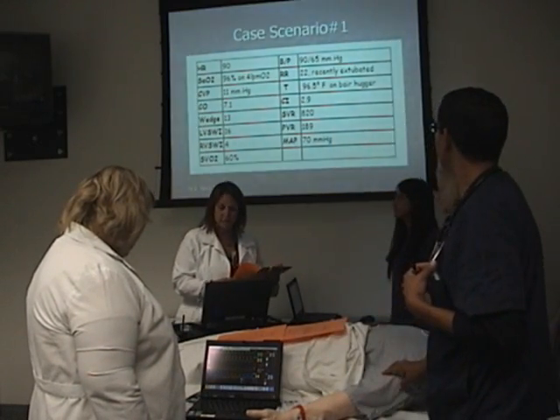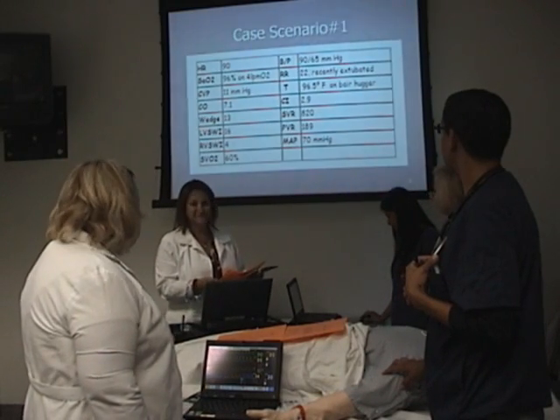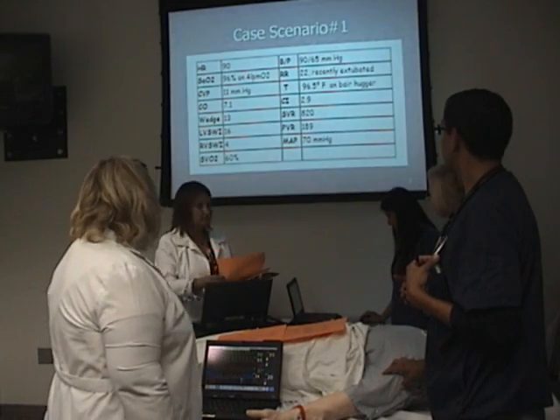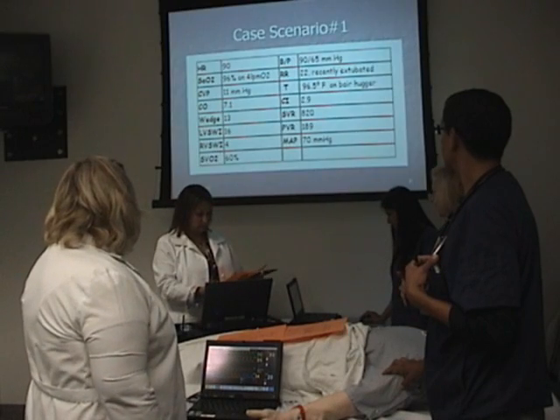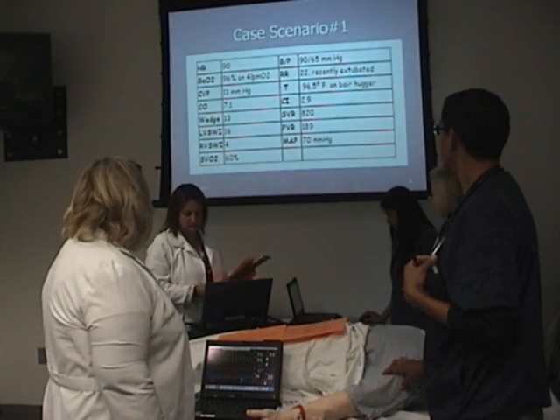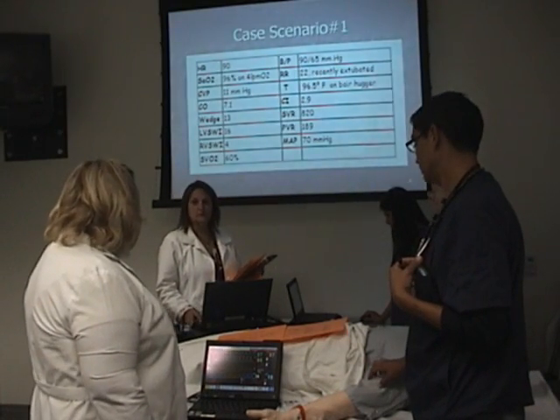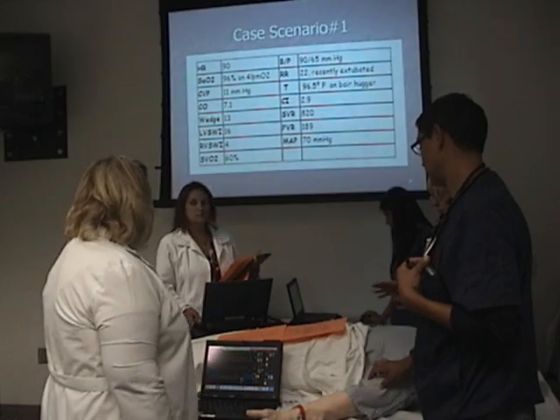Okay. What kind of changes have you noted? Well, the blood pressure's a little bit better. Our index and output look better. Oh, actually, great. SVR is down, so that's good. And the wedge is up with the volume that we gave, so that's good. CVP and wedge. At this heart rate, I'd still be watching it.